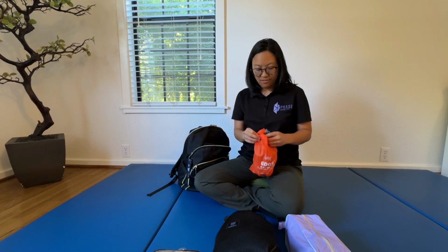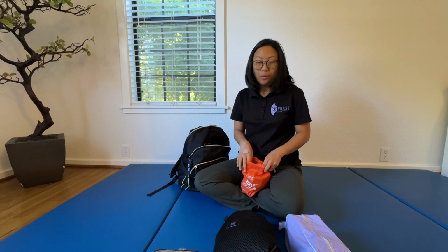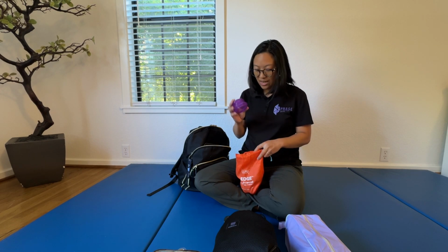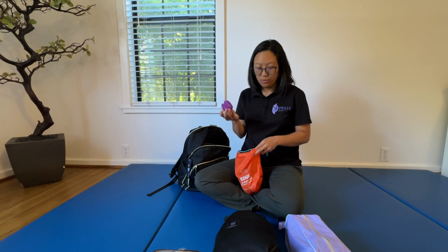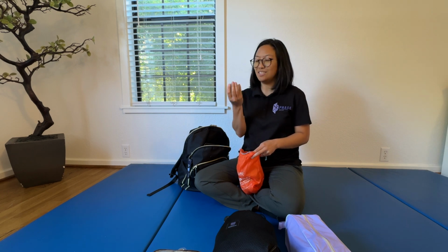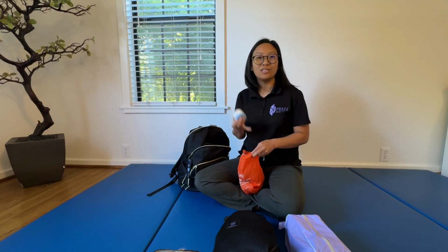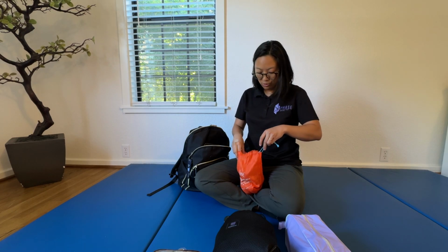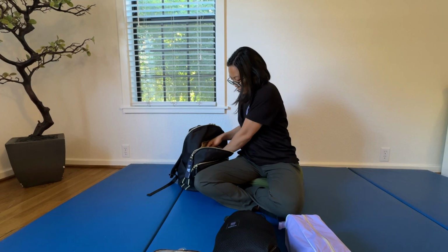And then here I have my dynamic cups. I just bought these off of Amazon way back in the day, and way back in the day, it's not been that long. But yeah, I just have a few different sizes. It's kind of nice. They can nest into one another, but realistically, because of how often I pull them out, I sort of just grab them. And then I have reused this little lotion case to keep all of my soft tissue cream in there. So that's kind of a nice quick little grab bag for all of my dynamic cups.